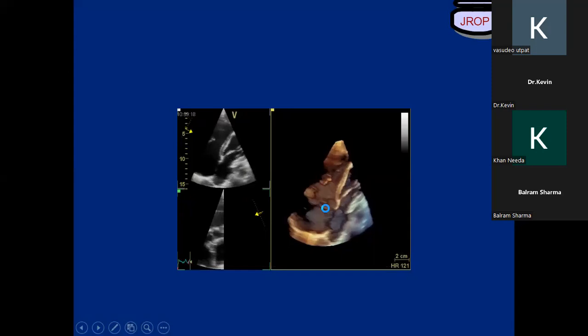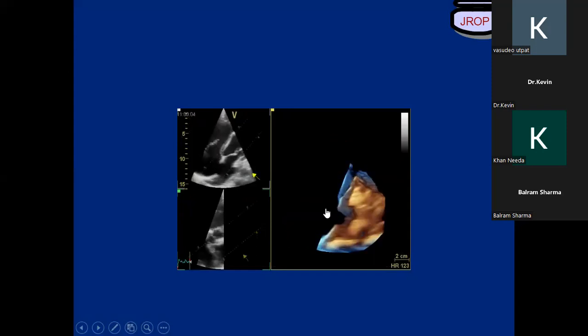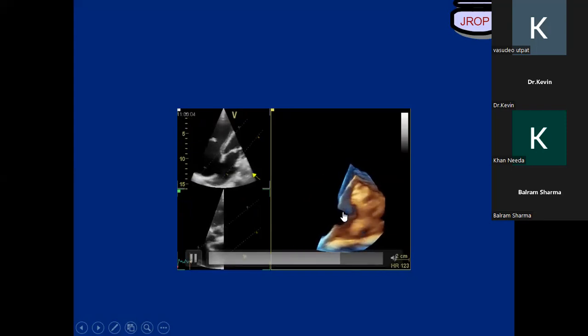And when we do this kind of thing in transesophageal echo, as I'm able to do it over here a little bit, this is the tricuspid valve. So this is the margin of the atrial septal defect. This is what is seen over here, and this is the hole out here. If I move it in an end-face view, I'll be able to see the whole of this atrial septal defect.